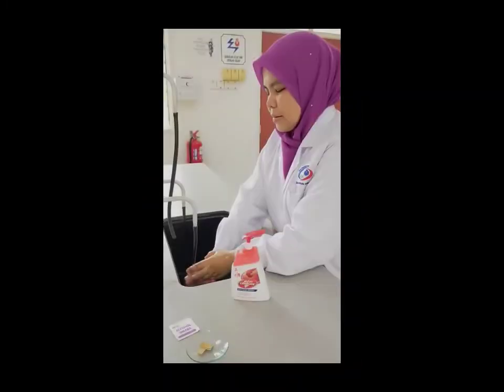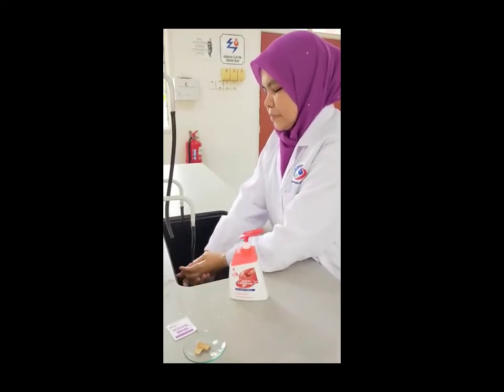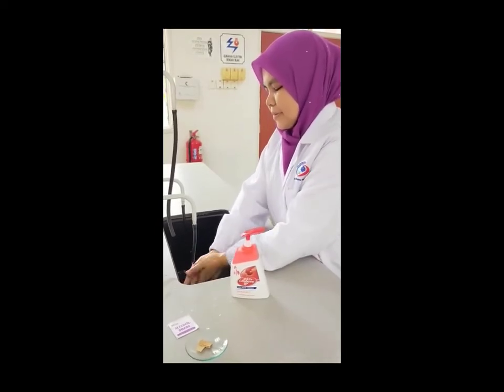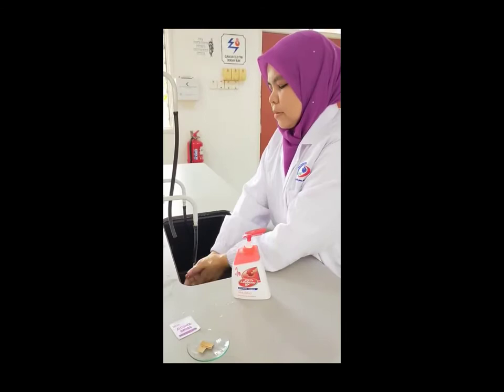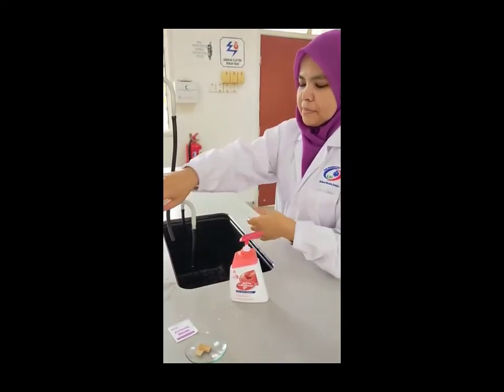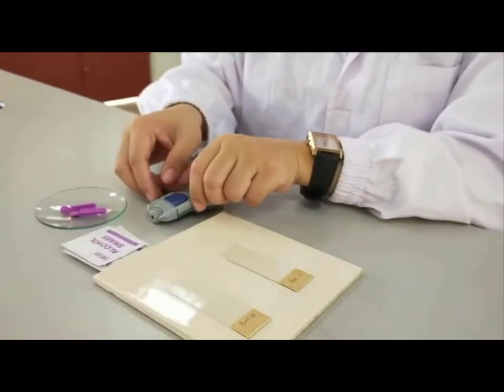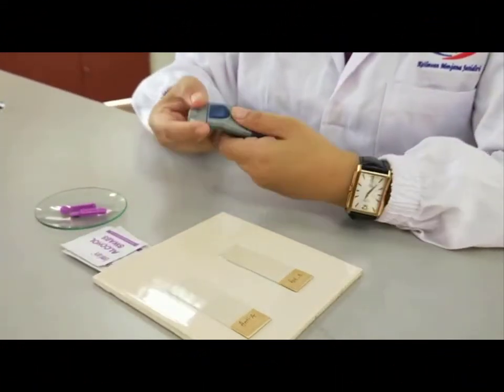For the next procedure, you have to clean both of your hands, wash them using the soap provided. Once you're done, let them dry. For the next procedure, swing both of your hands for about 10 to 15 seconds and prepare to prick your finger. Next we are going to prepare our lancing device.